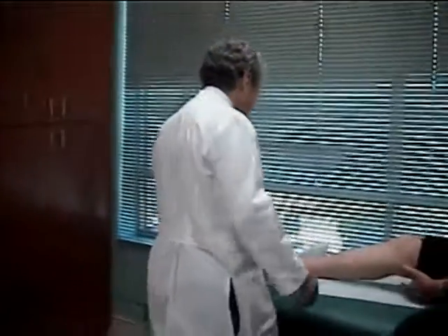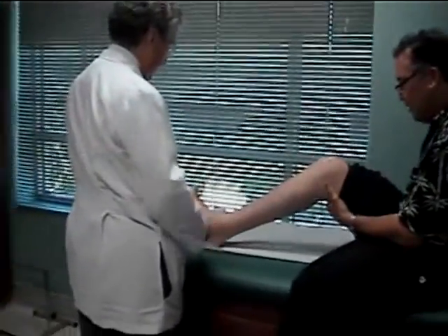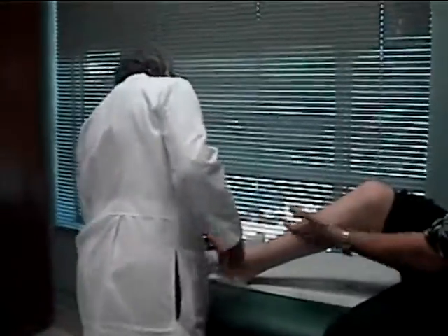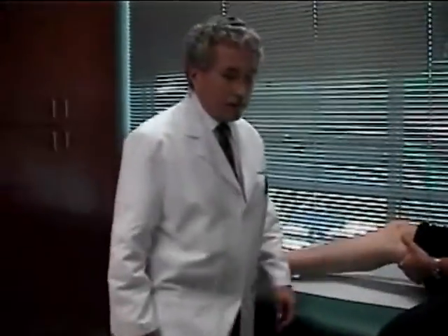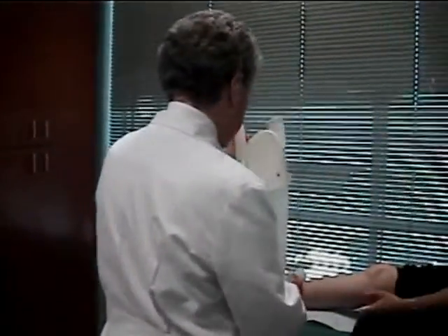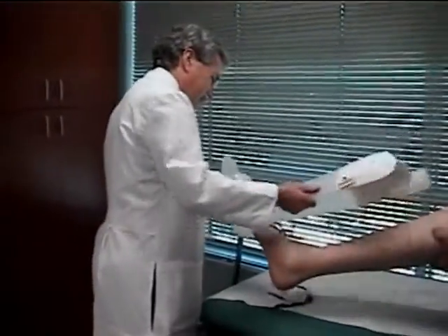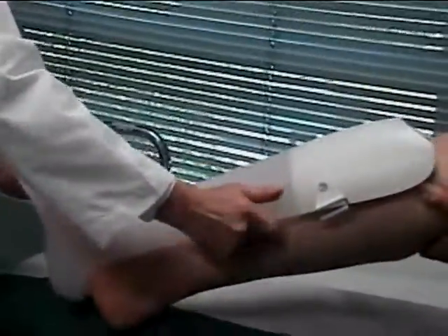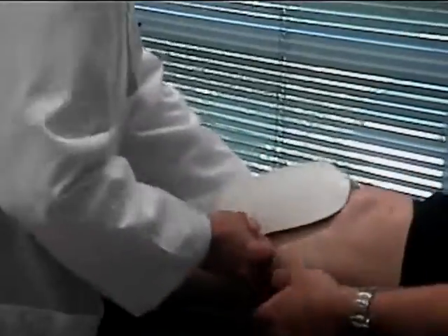Pull your foot up. Beyond 90 degrees - it's good, perfect, beyond what it has to be. It seems like it moves a little better. I think the therapy will help a lot. I hope it works better than it did - it didn't work good before. You didn't have the rings to go in there before.